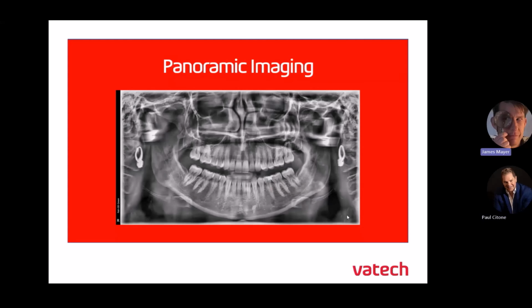Right. So here's a really nice image. I would say this patient's been positioned properly, but Paul, what are you seeing in the image? Well, I would say the head's tilted slightly, but we see the earrings in the image. And then again, also the streaking above that look like little rectangles are from the earrings. Yeah, so I think that's the thing of, we get our earrings in here and the sinuses, we get that streaking effect and the distortion above those earrings.